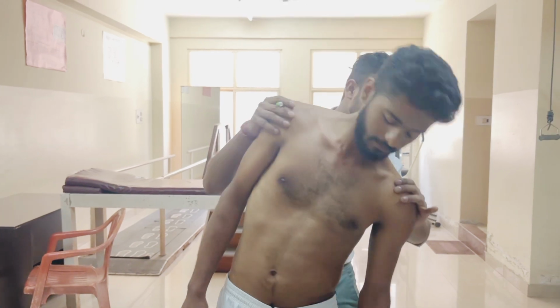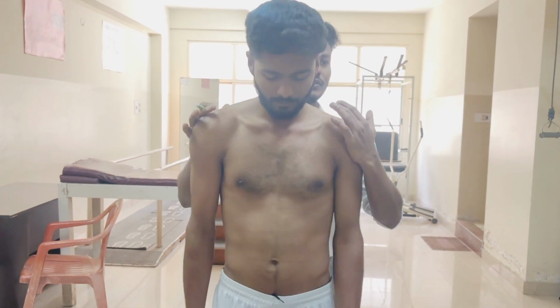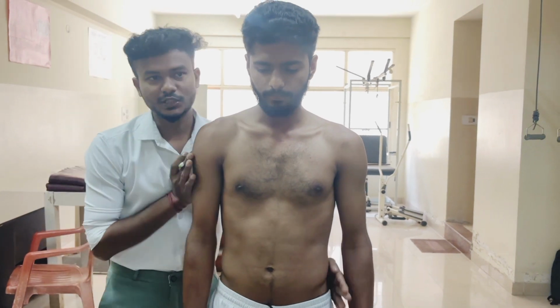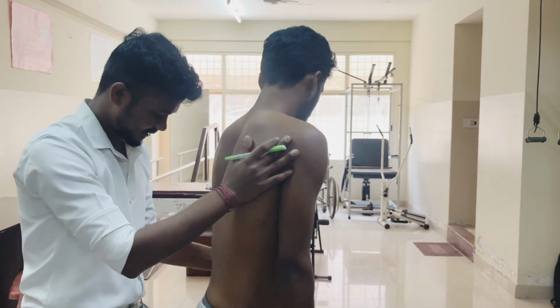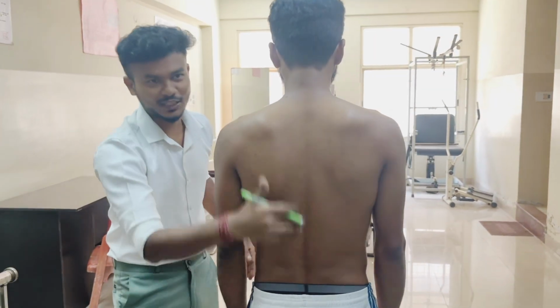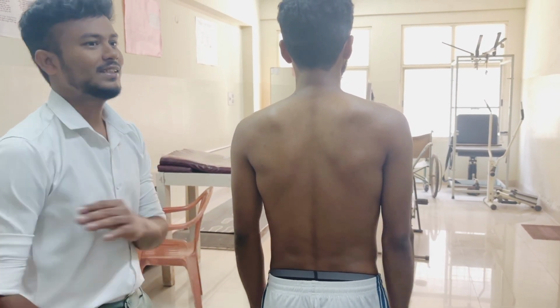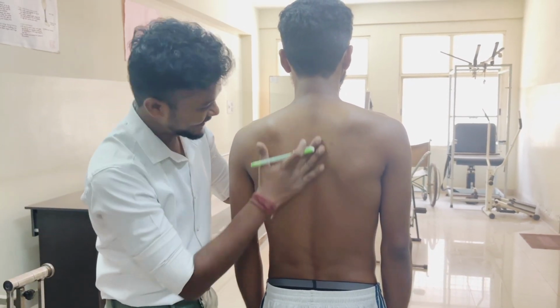Now we will see side flexion, and after that we will be having rotation. So these are the movements we are having. First we will see the flexion movement. So to measure this with a goniometer, we will see here.